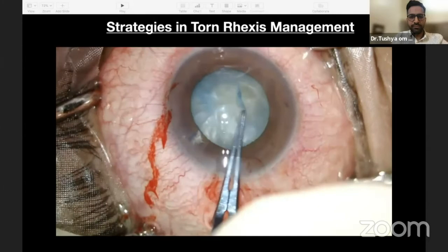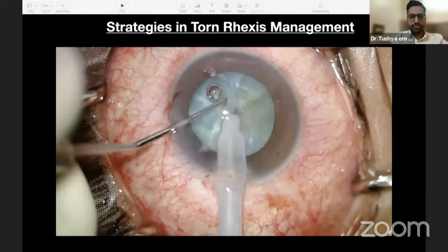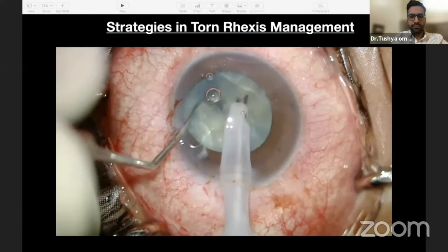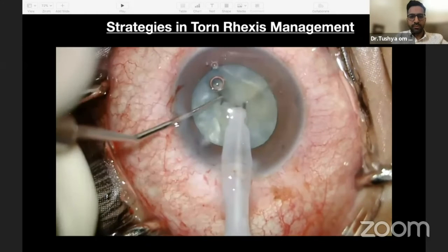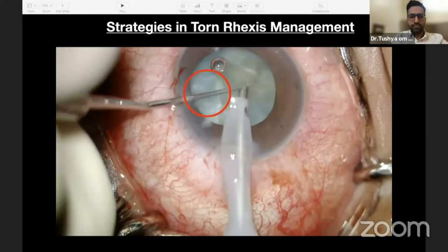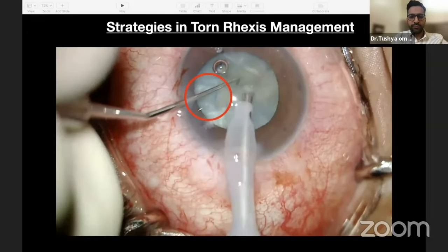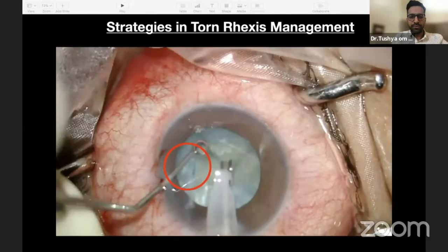I preferred chop technique with first chop done without much separational forces and not 90 degrees to the tear. At the same time, my focus was on trypan blue stained anterior capsular tear. It was fluttering and everted. Nuclear emulsification was done at iris plane.